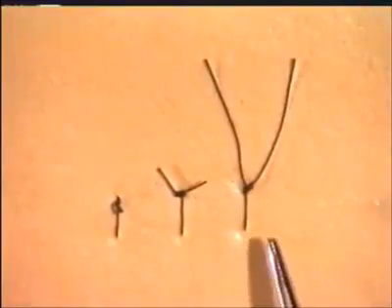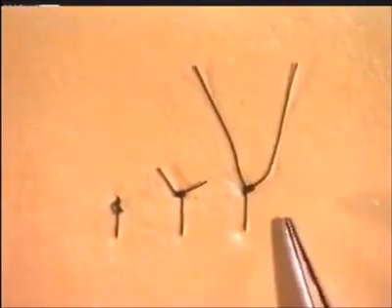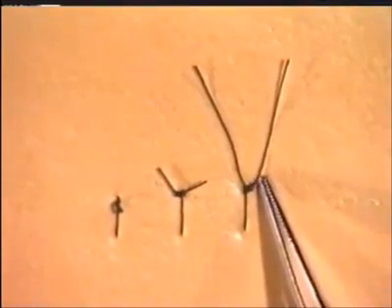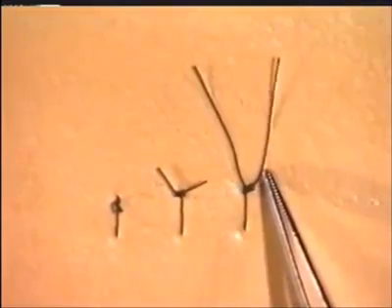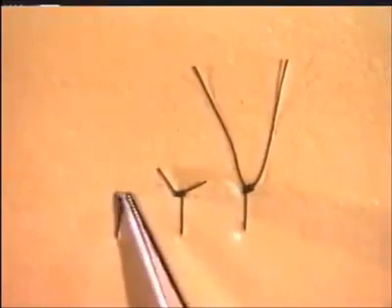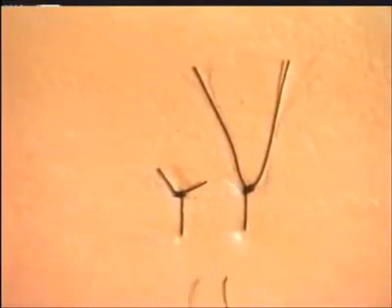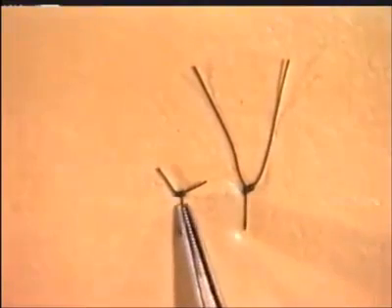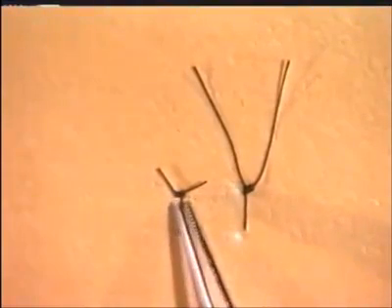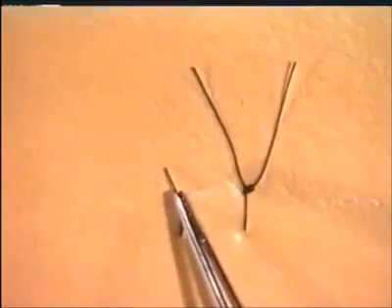When cutting sutures, do not cut them too long, as this long length of thread will be a needless waste of suture material, and will get caught up in the wound or in the dressings. However, don't cut them too short, otherwise this will be insecure, and might even lead to the unravelling of the knot. Cut the suture to such a length that it will be secure, and also allow the suture to be grasped during its subsequent removal.